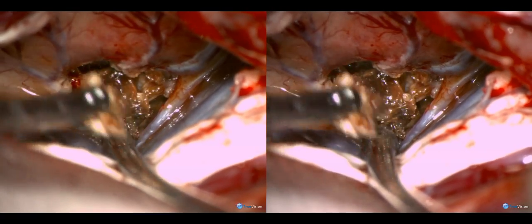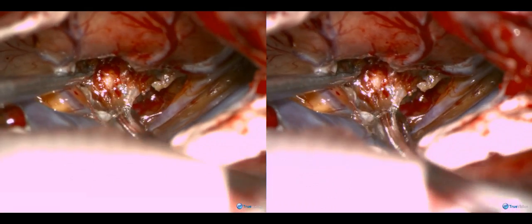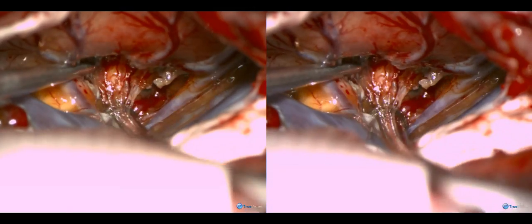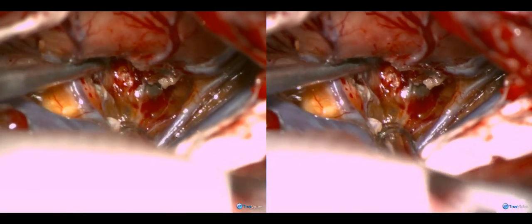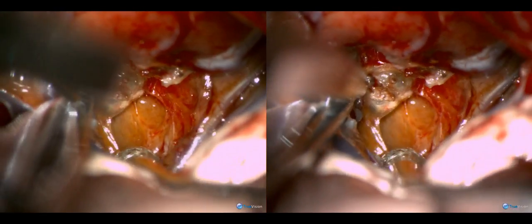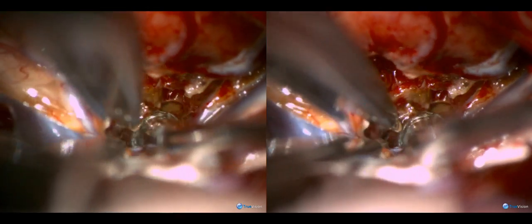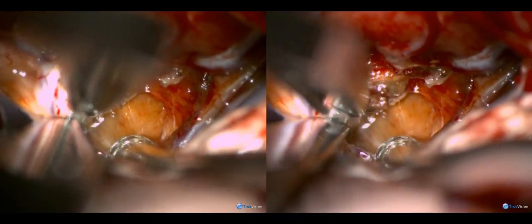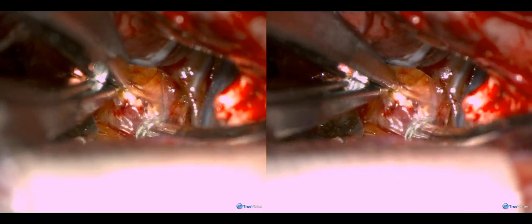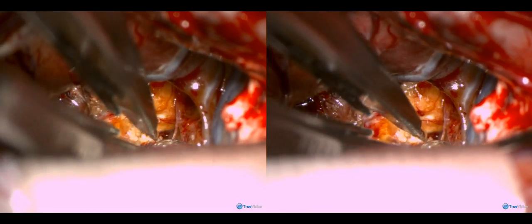The malformation is seen here being separated from its gliotic plane. There is scar tissue that helps to separate it from the adjacent brain. As the depths of the malformation are reached, we see a glimpse of the underlying optic apparatus.